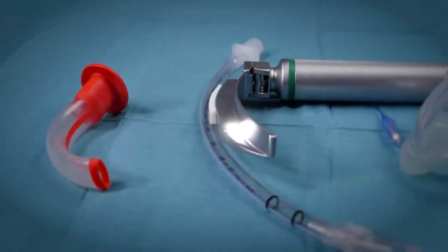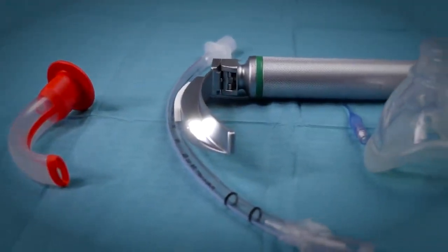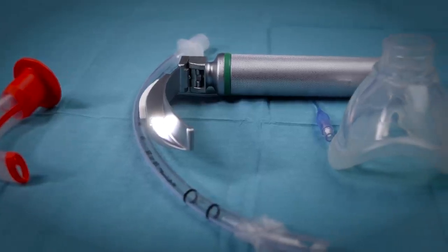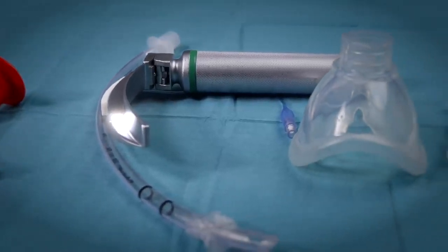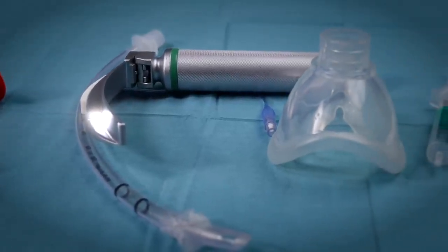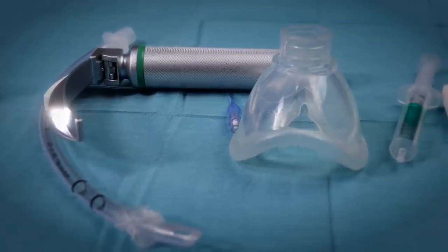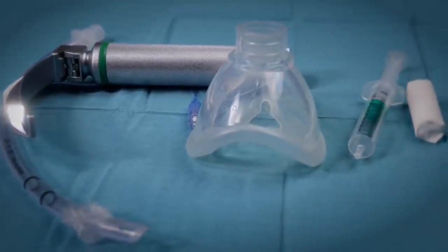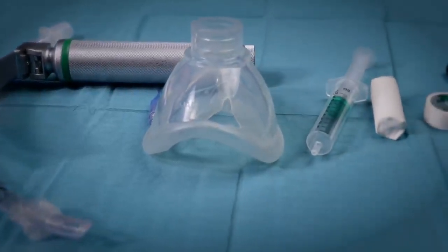Endotracheal intubation is an important part of airway management. It is best learnt through practice under expert supervision — in our opinion, first on a mannequin and then on elective, uncomplicated, and fasted patients.